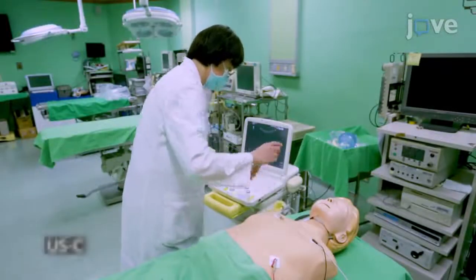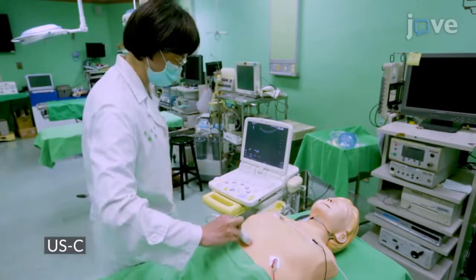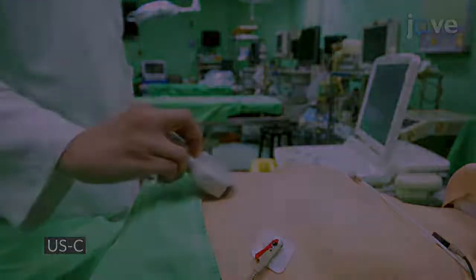At the start of CPR and at the end of the first 5 cycles of chest compressions, use the subxiphoid 4-chamber view.